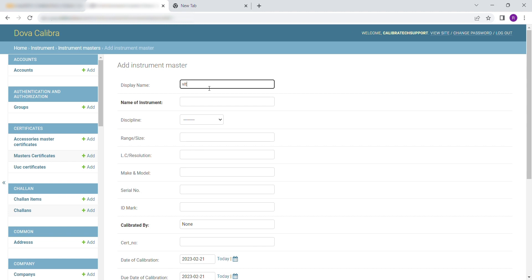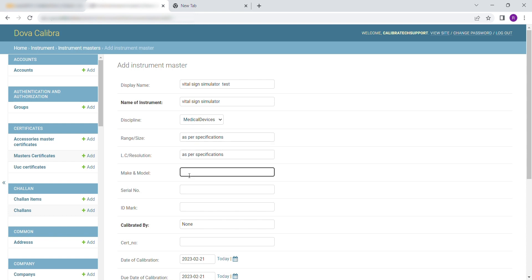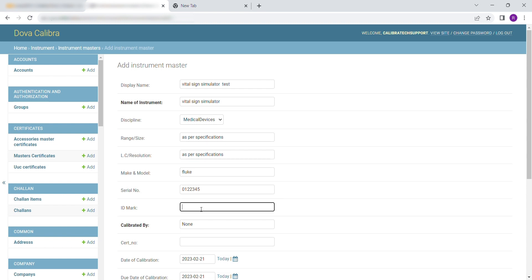Fill in the following details. Enter the display name. Enter the name of the Instrument. In Discipline, select Medical Devices. Enter LC as per Specifications. Enter Serial Number. Enter the ID Mark of the Instrument.